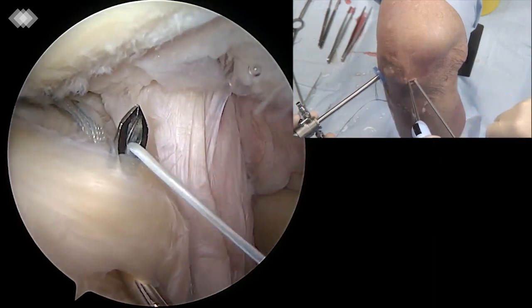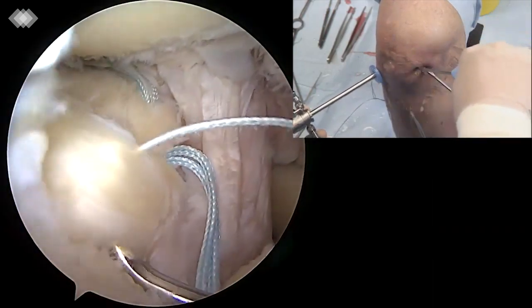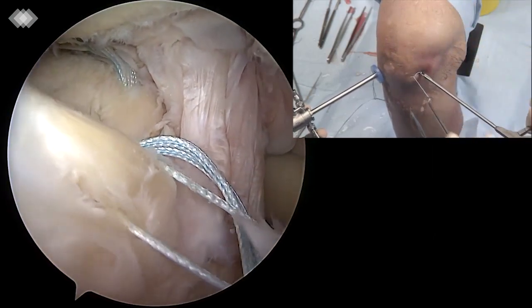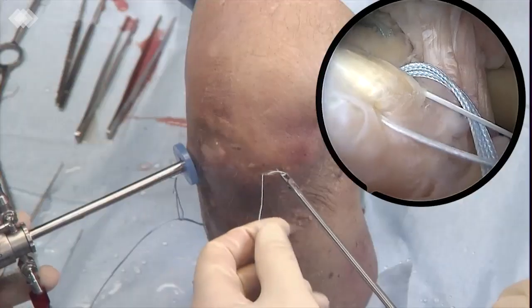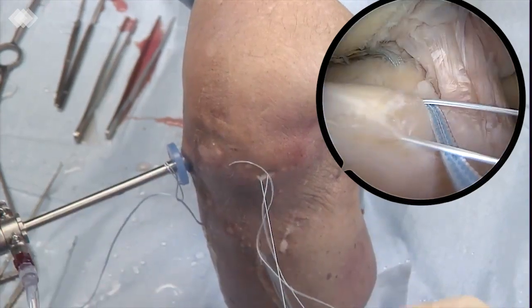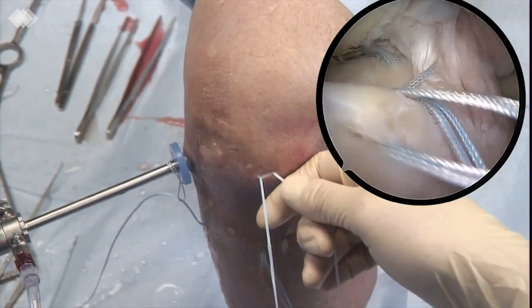A 45-degree curved right quick pass lasso is used to punch the anterior horn of the meniscus at 2cm medially to the anterior attachment. A fiber wire number 2 is used to guide the passage of the 1.3mm suture tape through the meniscus and the tibial tunnel.